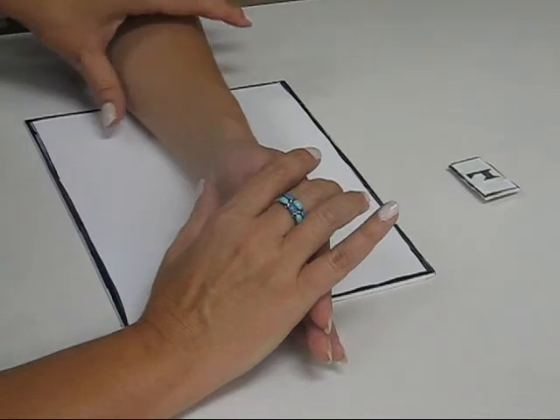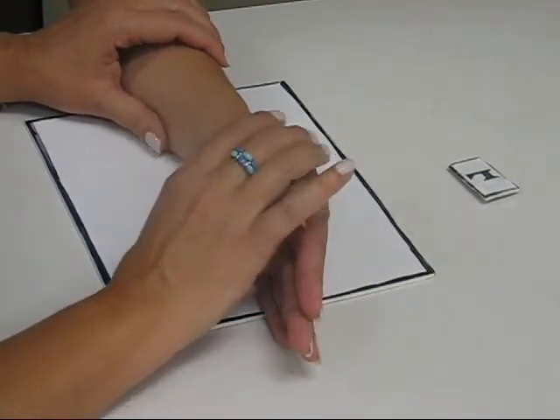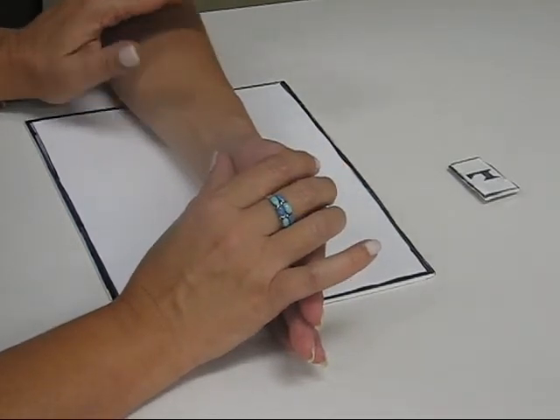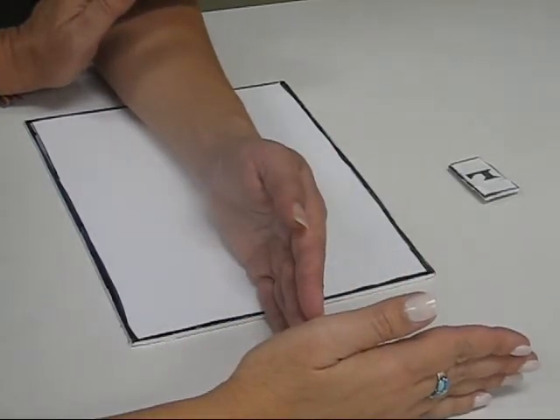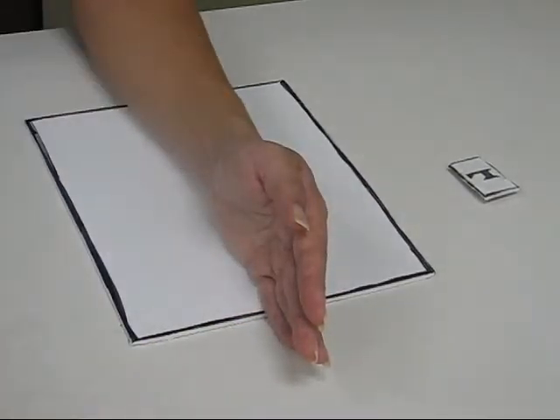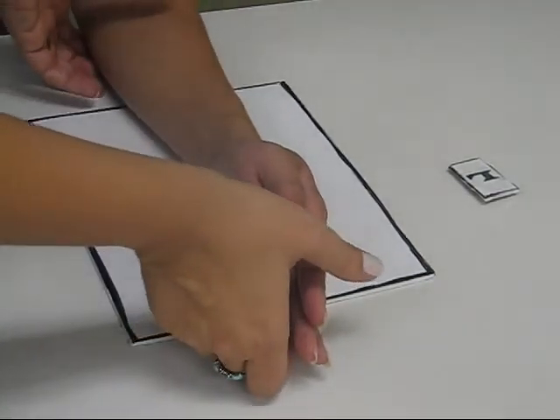There's some rotation of the bones when you're doing this sitting down. So it is better to do it with a 90-degree angle of the elbow. It makes for a more true lateral of the wrist. So that's your lateral of the wrist. You can go ahead and sit down again.